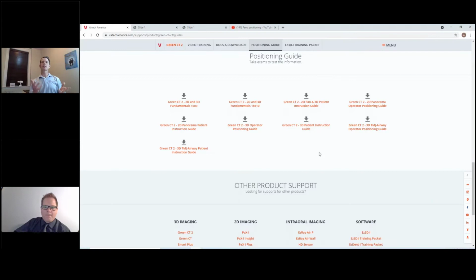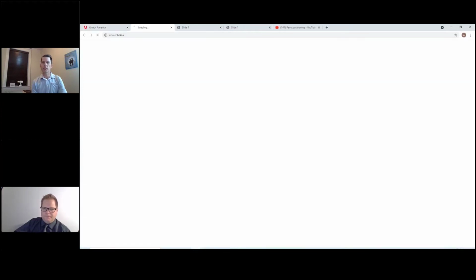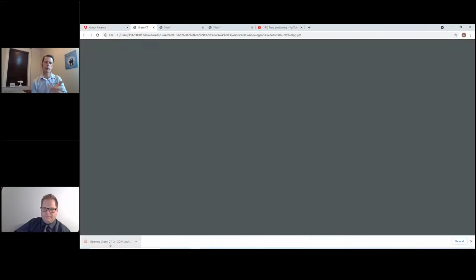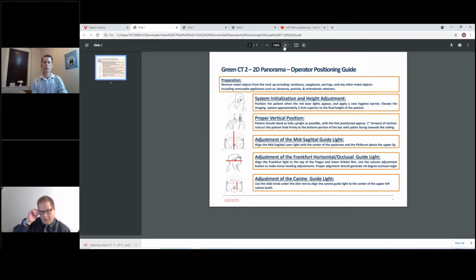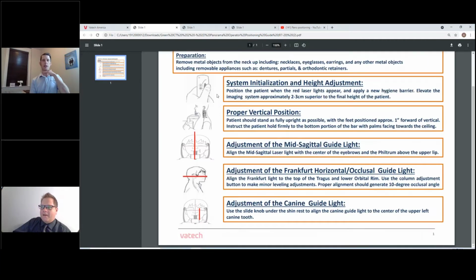So Paul, let's sum this all up with our 3 steps. I'm back at my customer learning center. I'm going to go through our 2D operator panoramic positioning guide here. It's a 1-page document you can also download, and this really takes us quickly through. Number 1, raising the machine up.